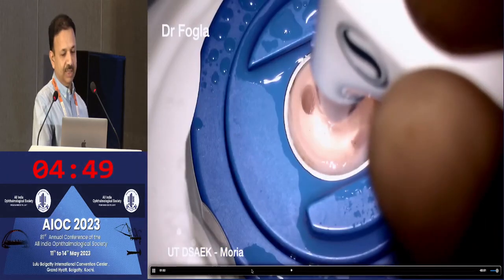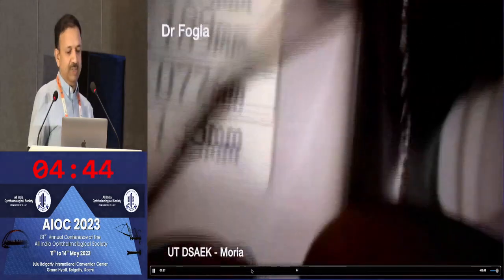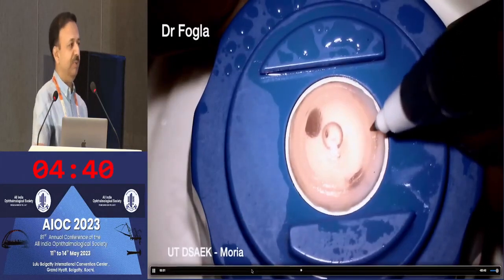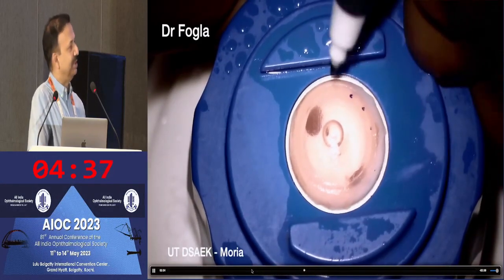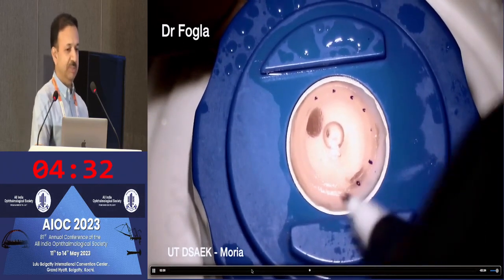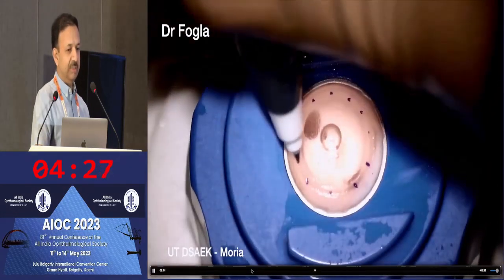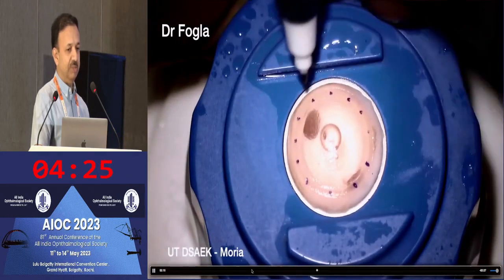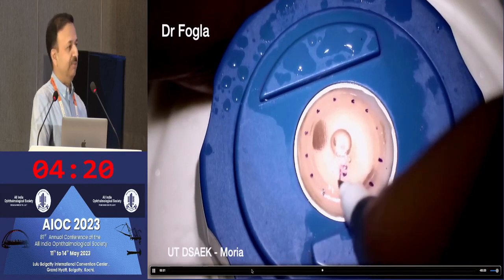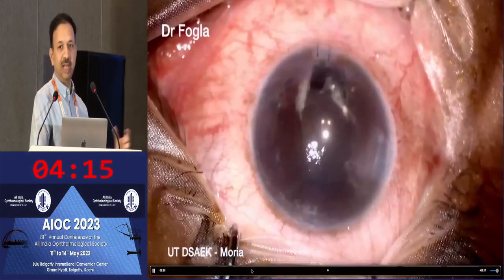You can see the thin lenticule that's been removed. We do pachymetry again and see that our measurement shows some variation — we were attempting 120 microns but ended up with about 77 microns. Before removing the tissue from the artificial chamber, it's important to mark the edge of the microkeratome cut. Otherwise, when punching from the endothelial side, you can punch eccentrically, resulting in variable thickness — very thin on one side and full thickness on the other.